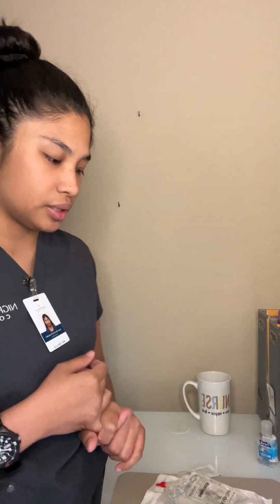Before administering anything to a patient, you'd want to check physician orders, check for patient identifiers, and check for allergies. Also, you'd want to check the 6 rights of medication administration, which are right patient, right medication, right dose, right time, right route, and right documentation. Making sure to cross-check this with the patient's chart, just to be sure.